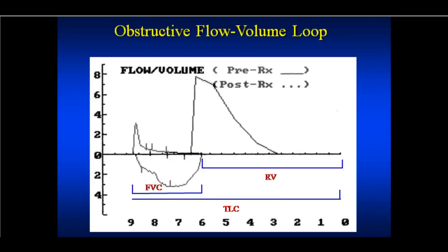So in this, one of the things you'll notice is that where the total lung capacity is in this gentleman, look how high it is. This person, because of loss of elastic recoil, loss of lung tissue, what's happened now? The chest wall has recoil and it wants to go this way. So you're losing inward recoil of the lung parenchyma, so now the chest wall wins, and anatomically the total lung capacity is higher. And this is called overdistension. All right, it's a critical term.